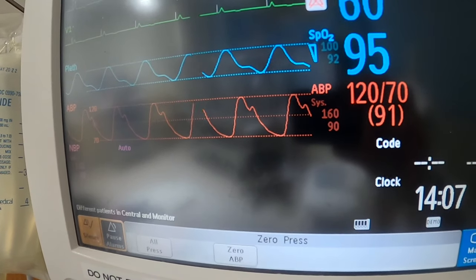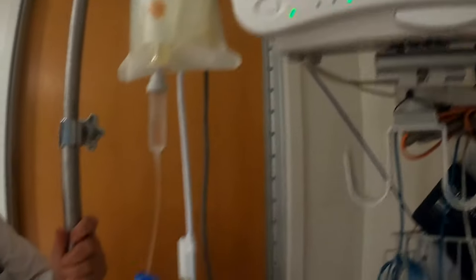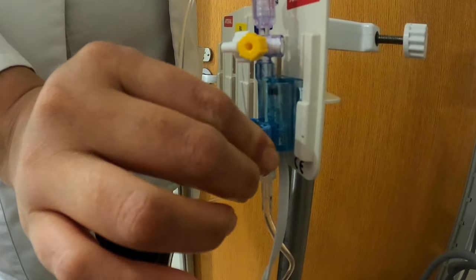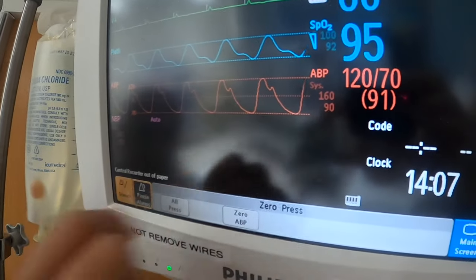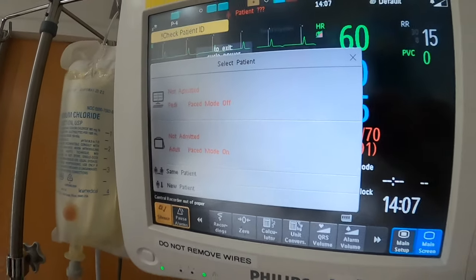Then you could do a square wave test. To do a square wave test, you need to go back to your transducer and squeeze it. The waveforms you now see on your monitor will change to square waves. I can show you pictures of how that would look, and that would conclude your zeroing.